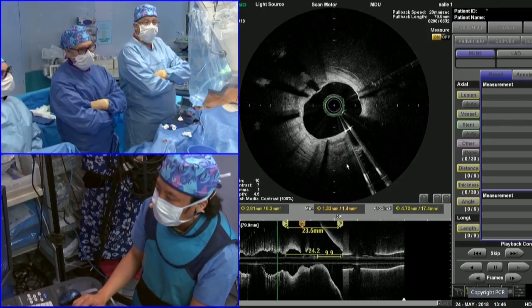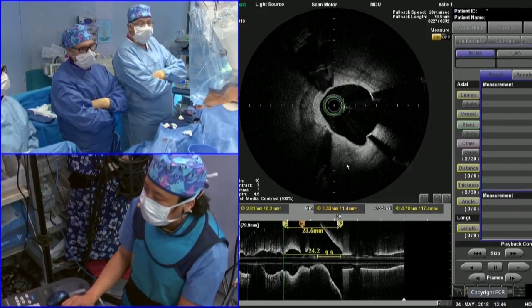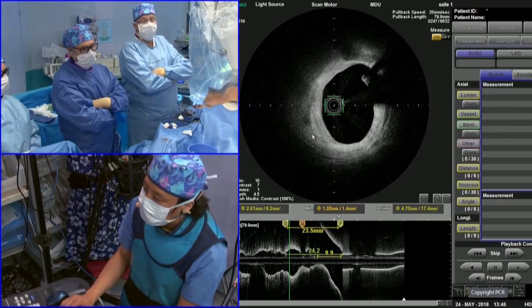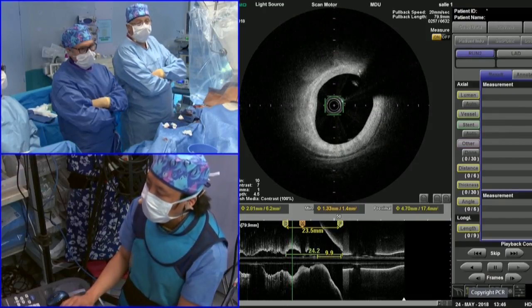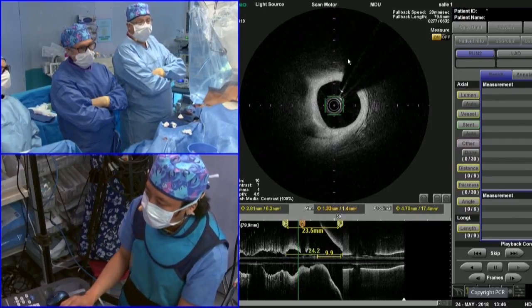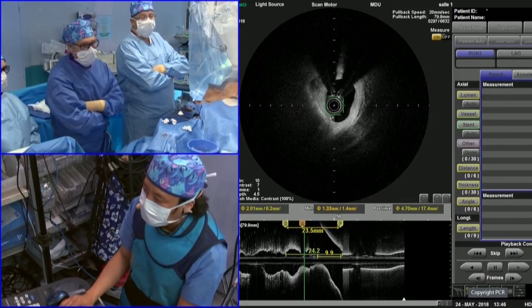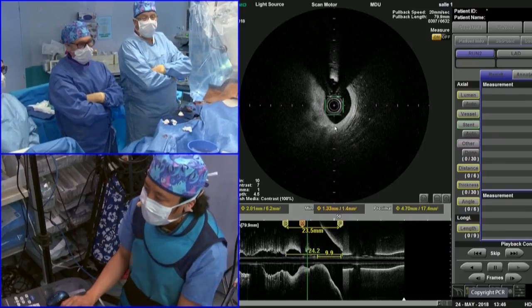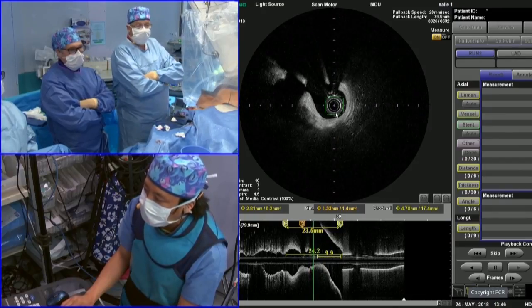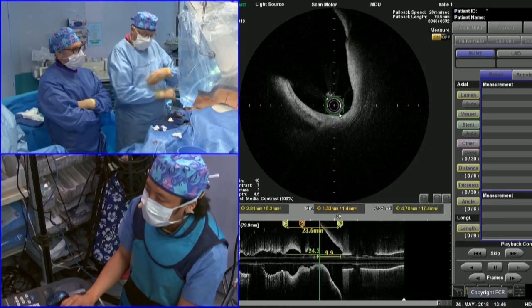Now I think we are coming to the end of this old stent, and you will see some severe stenosis starting from that. So it's still a calcified lesion, but here it's not too much calcified. You still see some calcification, but mainly the plaque characteristic is fibrous with some attenuation. So it's a fibrolipidic plaque from time to time. And this is a really severe stenosis here. You could see that the diagonal is already coming into this lumen, and you will see the third wire is coming to the lumen from the 12 o'clock.